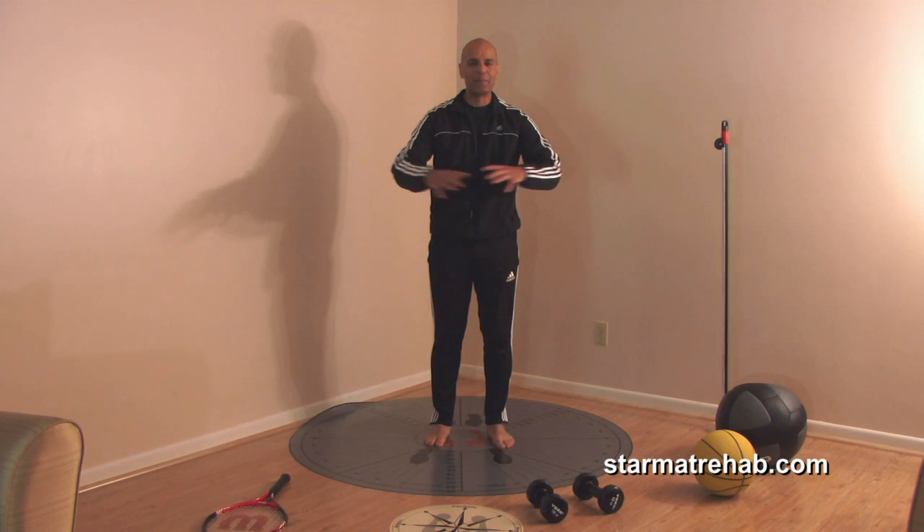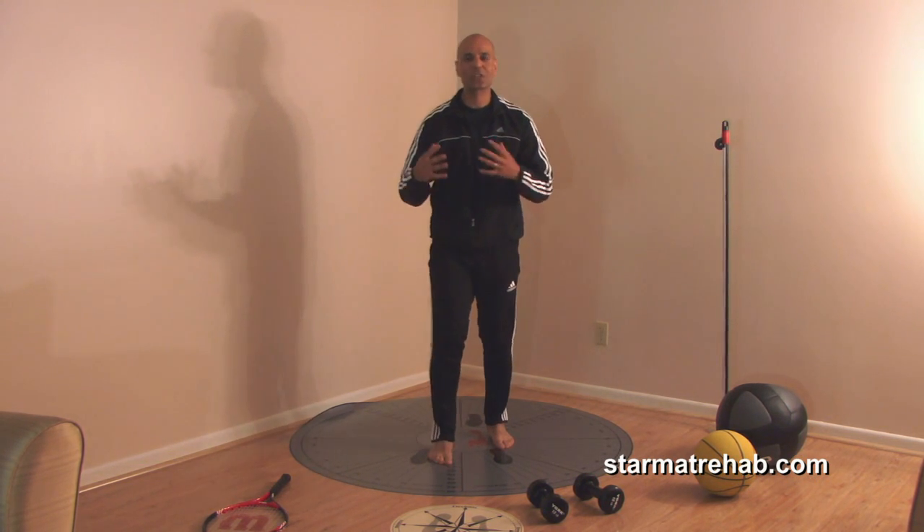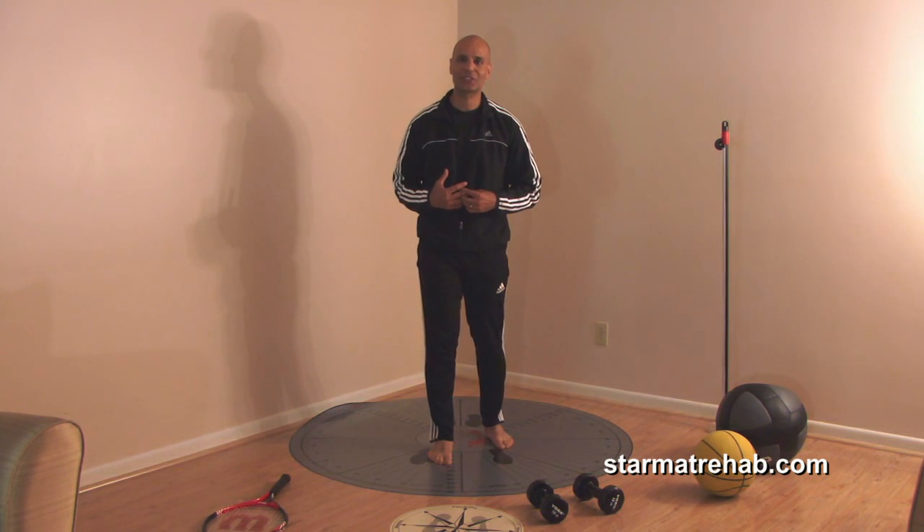I hope you can appreciate the limitless amount of exercises that can be done on the star mat, or just using the concept in these eight planes. I hope you found this short video educational and that many of your patients will benefit from these exercises. Thank you.